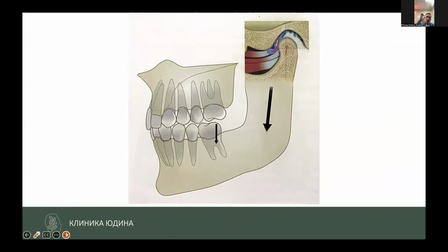The size of the anterior part of the TMJ disc should equal the height of the space between the fossa and the condyle. This same space should be created on the back teeth, and in all this space on the teeth you should insert the splint or another construction in your clinic.